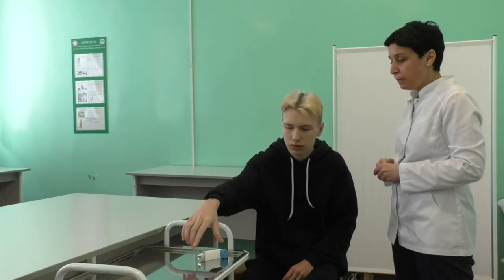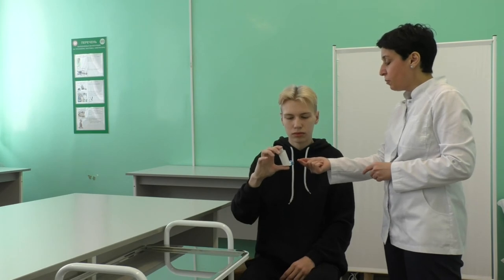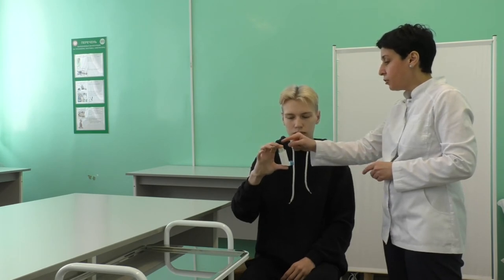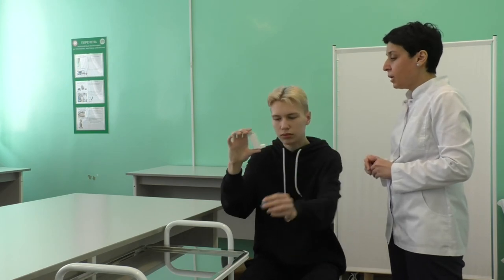Fingers should be positioned like this. The bottom of the inhaler must be held with the thumb and the inhaler must be turned upside down. The top of the inhaler must be held with the index finger.